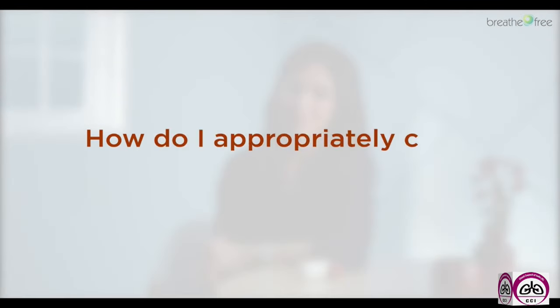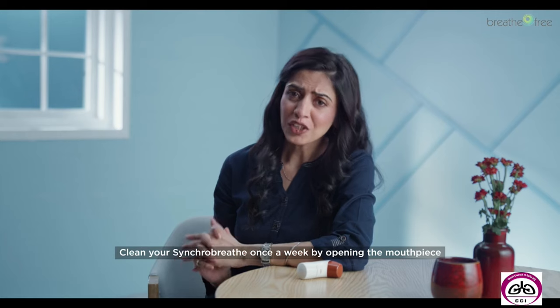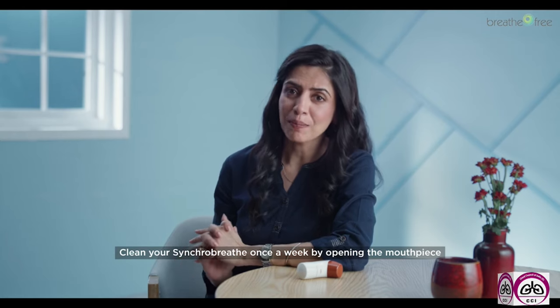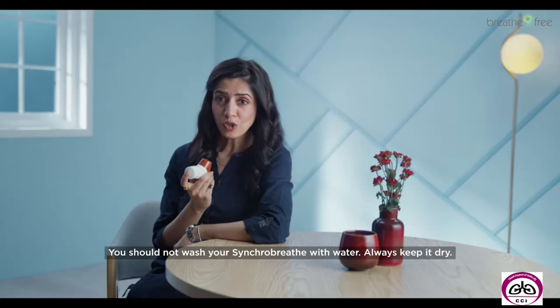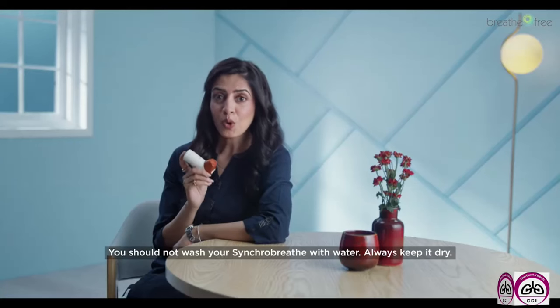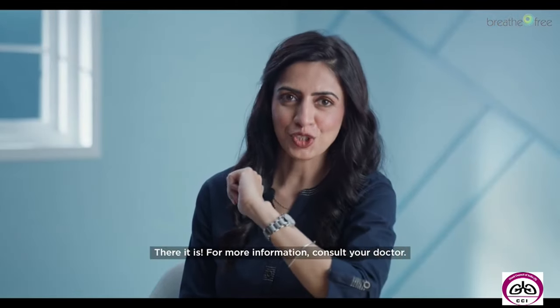How do I appropriately clean and store my SynchroBreathe? Clean your SynchroBreathe once a week by opening the mouthpiece and wiping with a dry cloth or tissue. You should not wash your SynchroBreathe with water. Always keep it dry. There it is. For more information, consult your doctor.